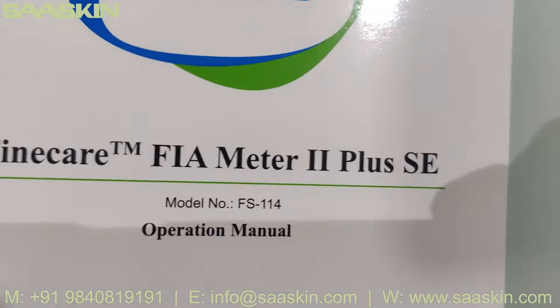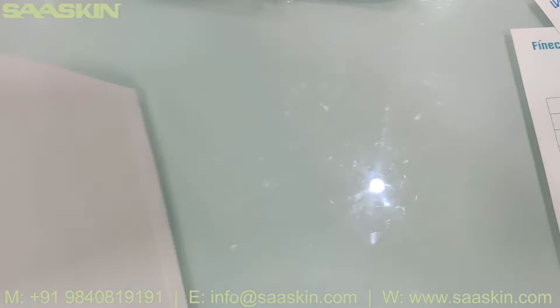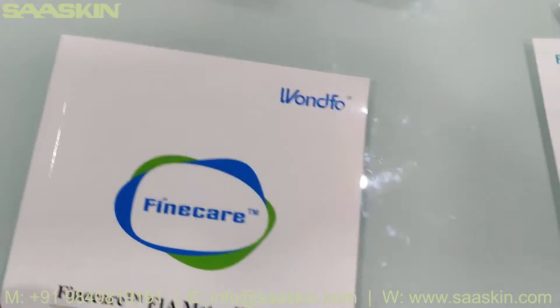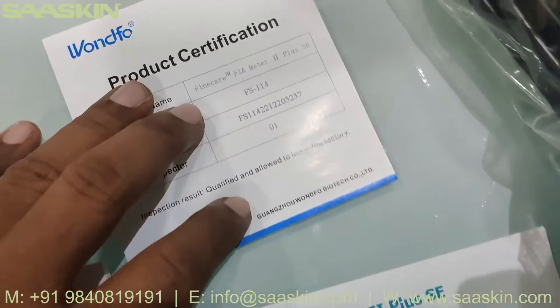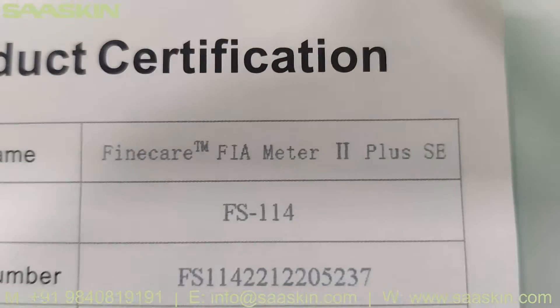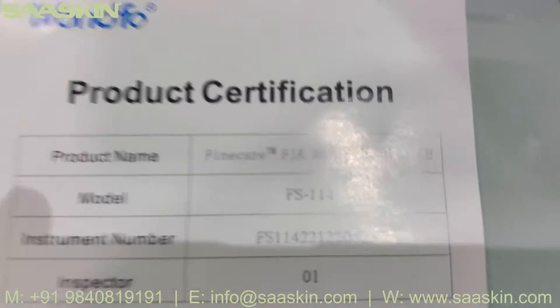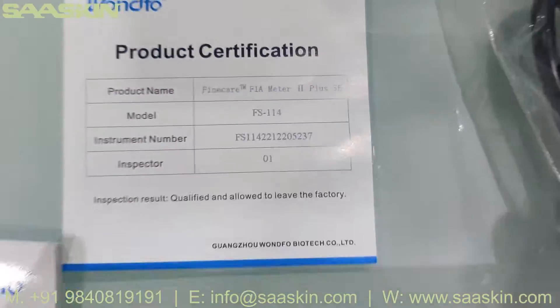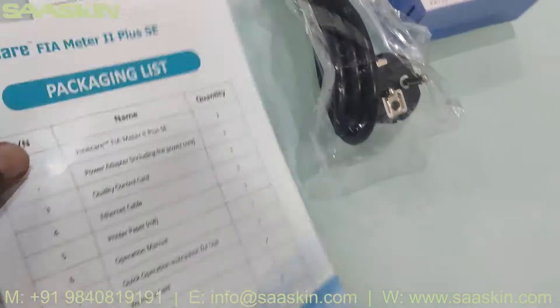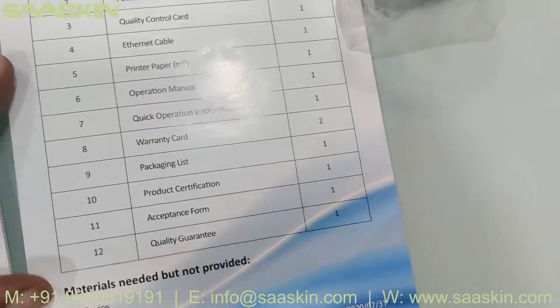There is one FineCare FIA Meter 2 Plus SE model FS114 operation manual. So you get a complete operation manual for conducting this test. And there is a product certification paper with the serial number and instrument number, inspection and product certification. It says FineCare FIA Meter 2 Plus SE FS114. You get a product certification and it's well organized. And also a packaging list that tells you the key contents inside this box.